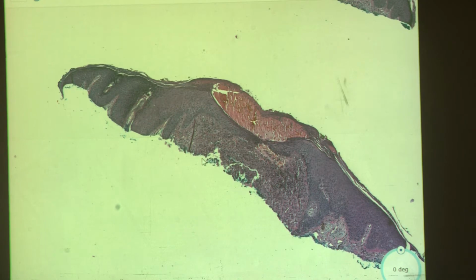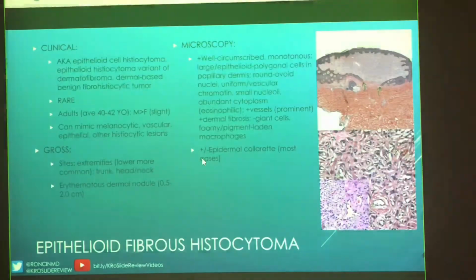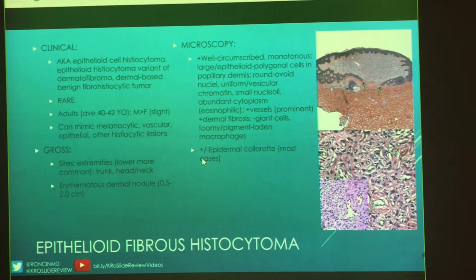Epithelioid something. But epithelioid, yes. So the next part in the name really isn't going to make much sense, but this is pertaining to this case in particular. But this is epithelioid fibrous histiocytoma. Not a lot of fibrousness going on, if that's really a term. If not, I just made one up. Okay, so a lot of different names that this has been called.